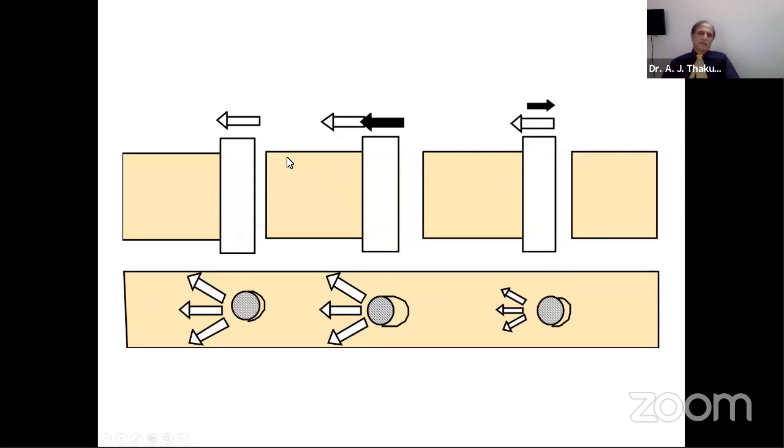What one could do is, after passing the screw in an exact proper hole, one could pre-stress it. That means push it to one side against the cortex, so it is under some kind of load. That is technically called pre-loading. So pre-loading can be done, where we push it to one side and hold it in a clamp. So whenever there is a load from this direction, the pin will move, but to a lesser extent. When it happens the other way around, it will also move, but to a lesser extent. This is definitely an improvement on the previous condition where no preload was applied.